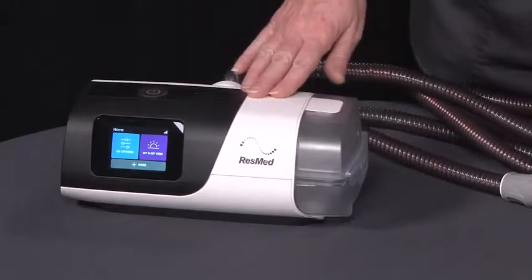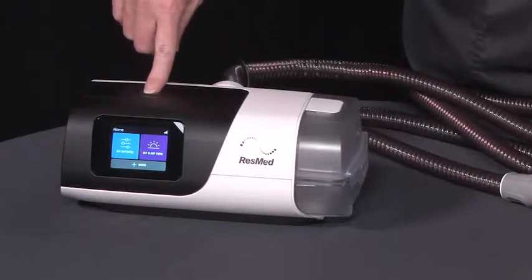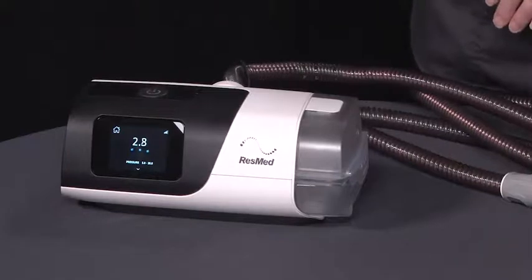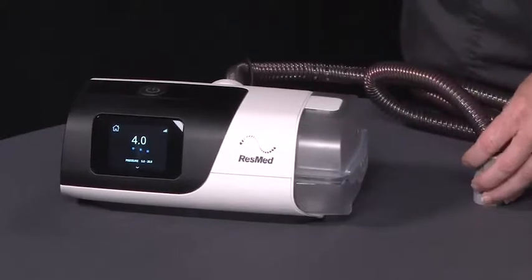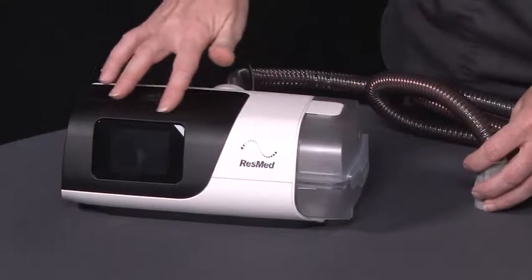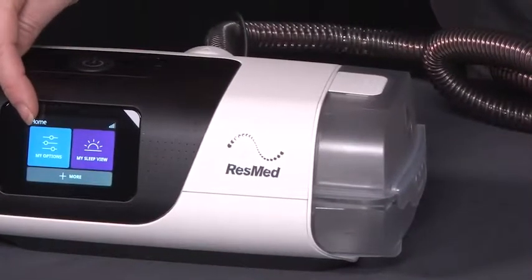To get started with therapy, it's a simple press of the button. You press the button on the top of the machine, and the machine will start up for you. You will hear that air coming out, and you will feel that air pressure on your mask. Your machine screen will come on with the pressure that it's supposed to come on at the start.